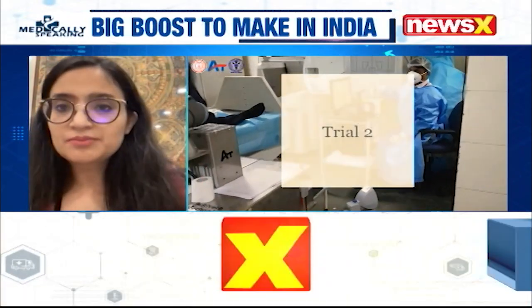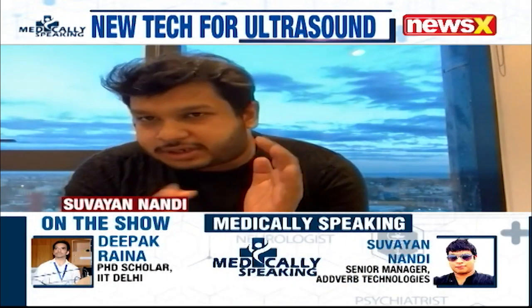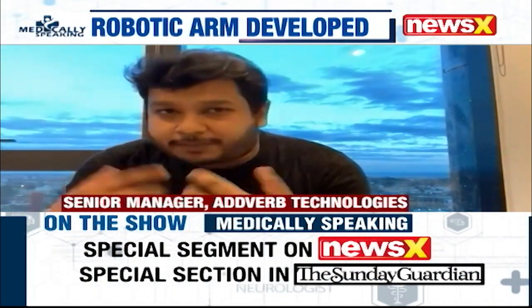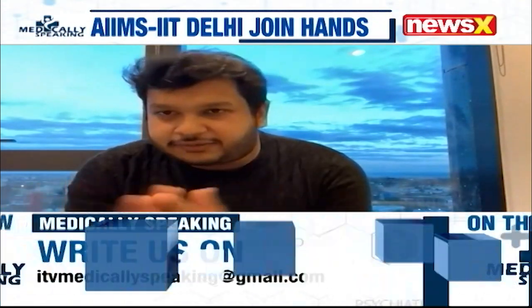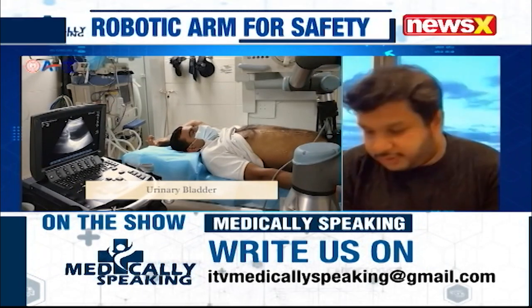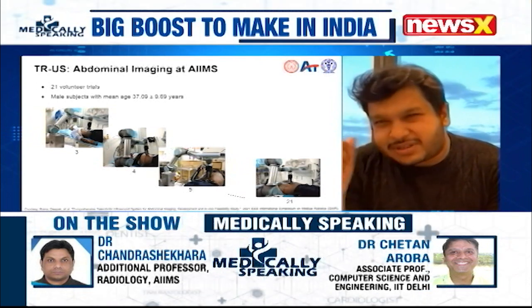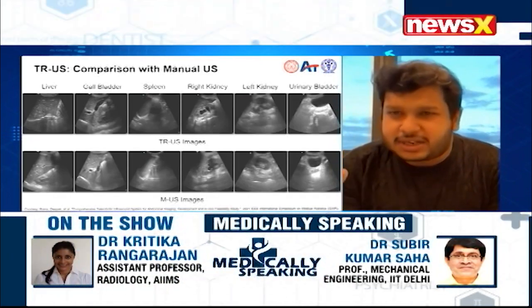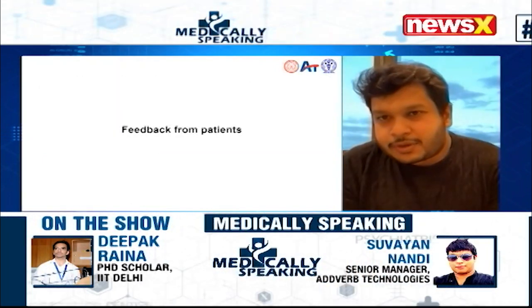Okay. So the robot which we have has a force-torque sensor in it, which can get the feedback of how much pressure is being applied on the patient. So we already keep it under check that it is less than 20 Newton, so that it doesn't hurt the patient. And apart from that, as part of what we call a safety integrity level, SIL 3, we have maintained a foot pedal with the doctor, and a hand emergency button with the patient. So whenever he feels any discomfort, any one of them can disengage it and stop the robot.